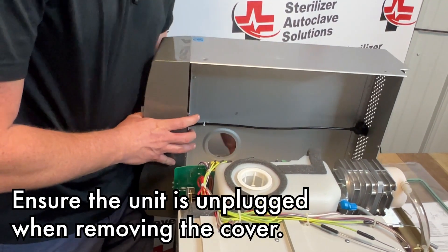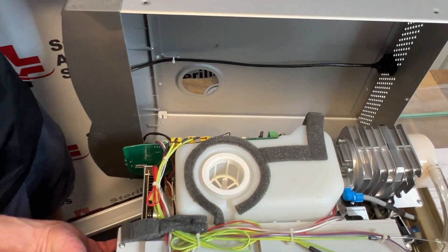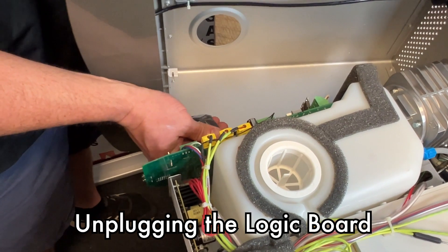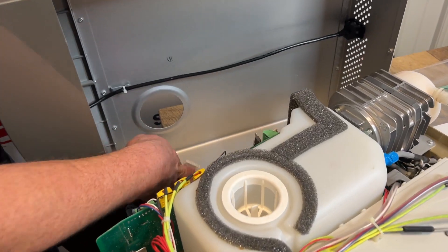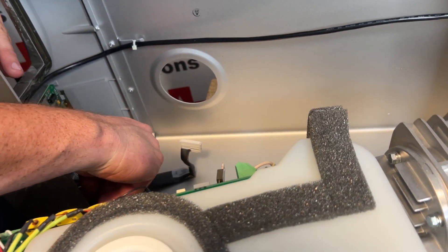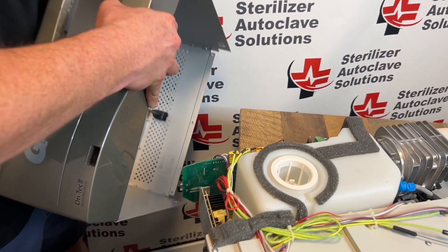You always want to make sure you're unplugged when doing this. You have a couple of ribbon cables depending on the year of your unit. This one has a power supply board, so I'm going to unplug our logic board from the main board. Once the ribbon cable is unplugged from the main board, follow back where the power supply board logs in and unplug that as well. That will free up the top cover to be moved to the side.